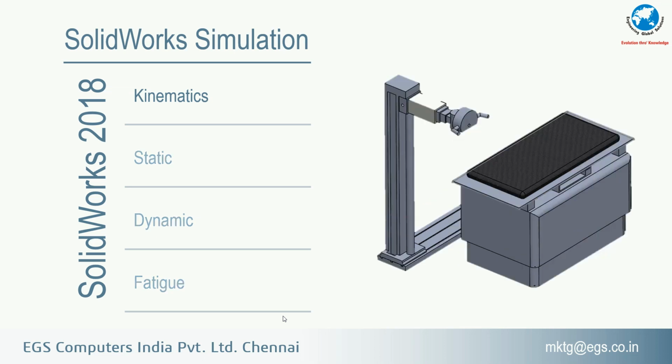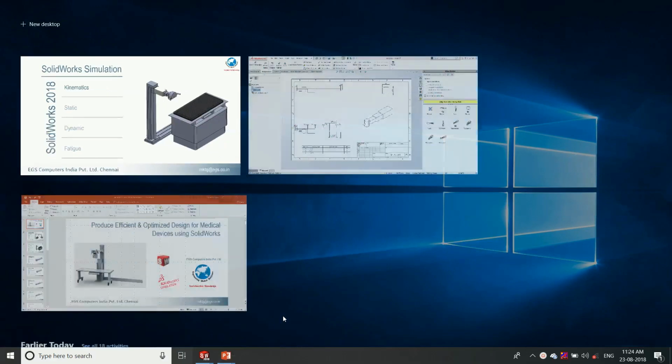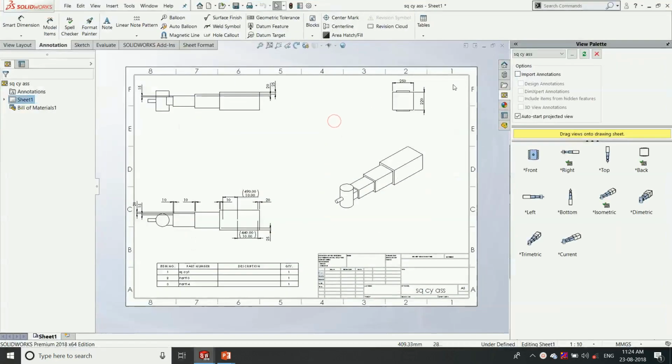So in the kinematic study we are going to simulate the motion of these mechanisms, so that in real-time conditions, if there is any lag in the performance, we can analyze it here itself. So in this kinematic study we will analyze the mechanism movements, then we will get what the velocities or angular displacements are in the process.